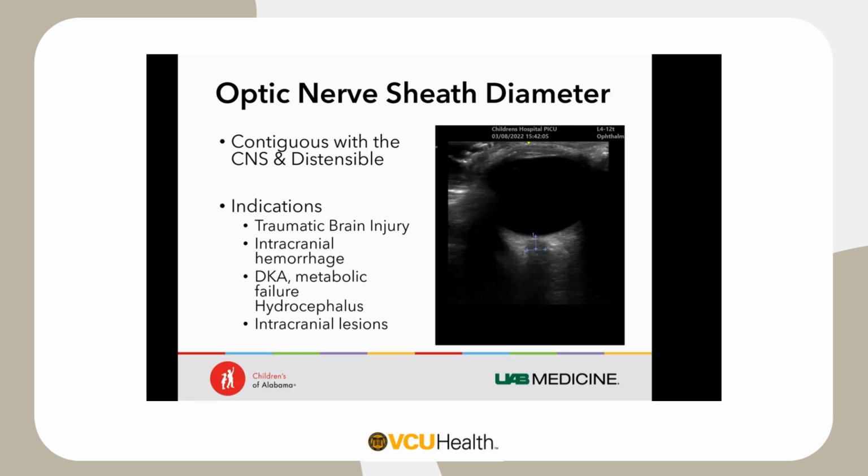which makes them perfect for indications for any intracranial pressure, but we've seen them used for traumatic brain injury, intracranial hemorrhage, DKA, or any other metabolic failure and changes, hydrocephalus, and intracranial lesions.